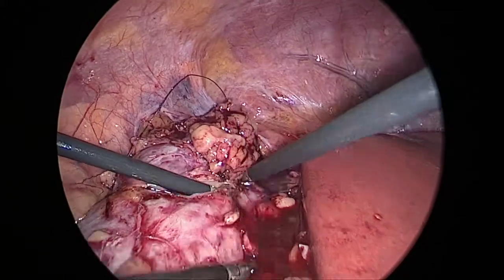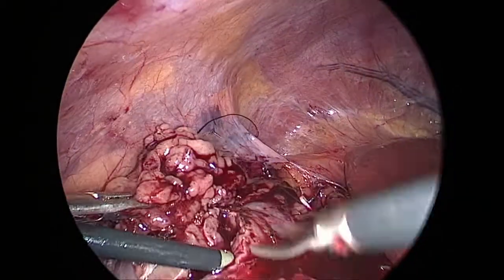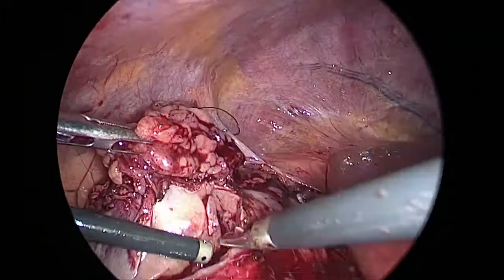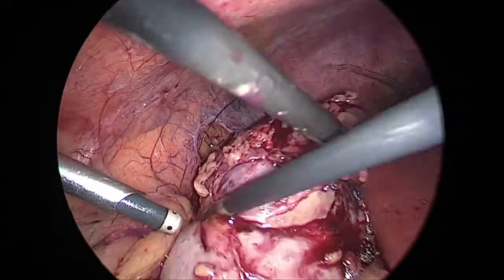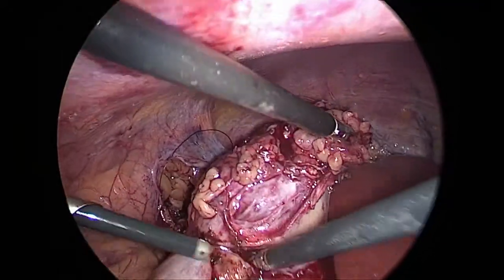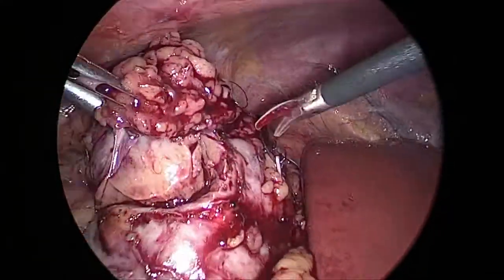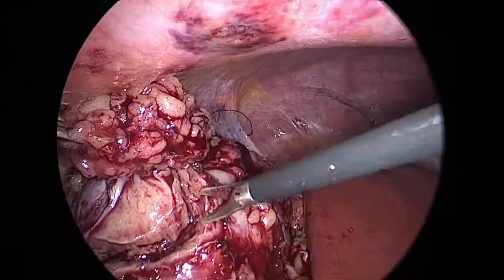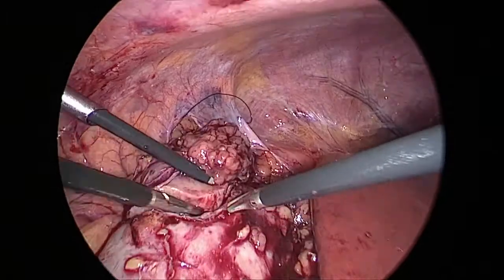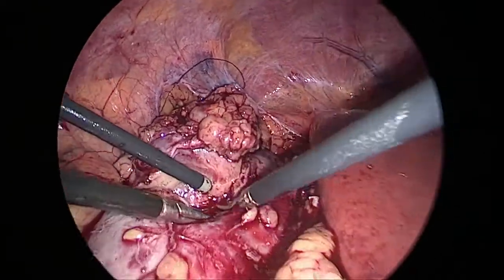Not only during the resection, during the whole procedure, the role of the assistant is very important. During resection, he has to retract the margin of the tumor and to suck continuously, but unfortunately my regular assistant was not present in this case. However, we resected it nicely without breaking the tumor capsule. It took a little longer time than usual.